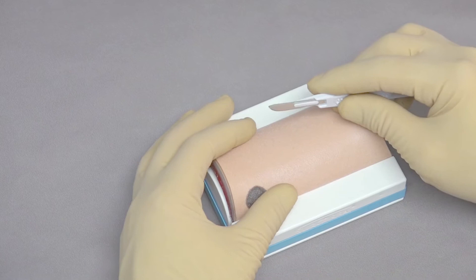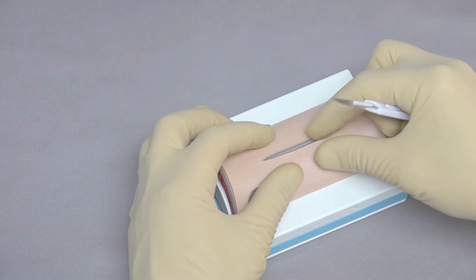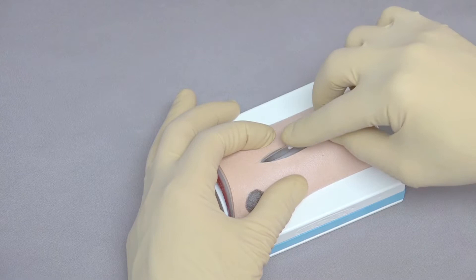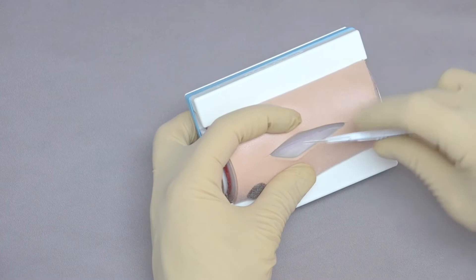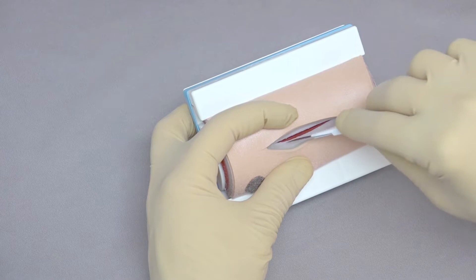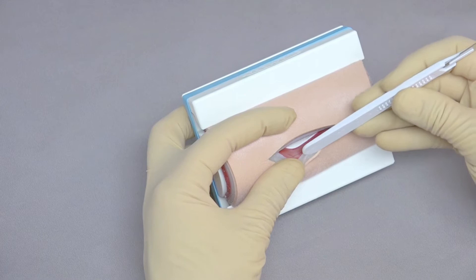Because we have five layers, we want to practice incising each layer individually. Place the bevel of the blade down and apply just enough pressure to get through the skin. With the tensioning base in place, it helps open the incision much as it would for a regular incision. Continue down through the subcutaneous layers until you reach the first fascial layer. As you continue through the first fascial layer, you can see the muscle appearing. Then continue down through the muscle all the way through to the deep fascial layer. You can see all five layers: the deep fascia, muscle, superficial fascia, subcutaneous, and skin.